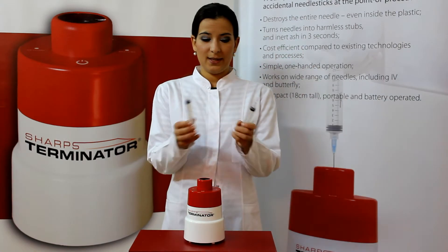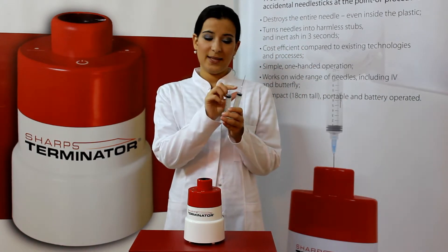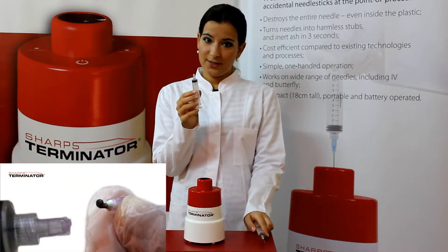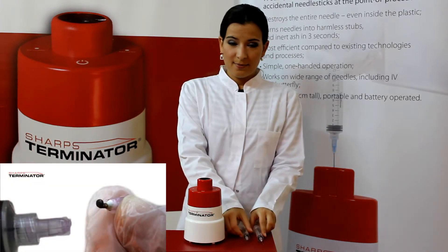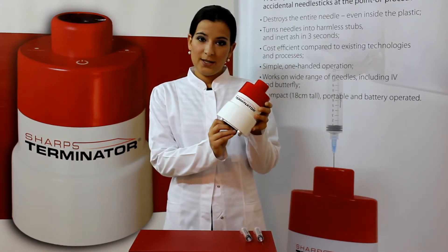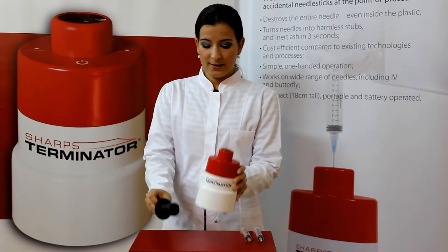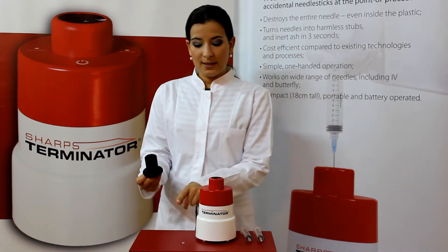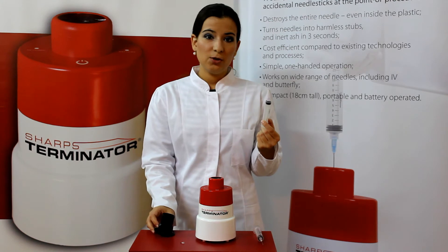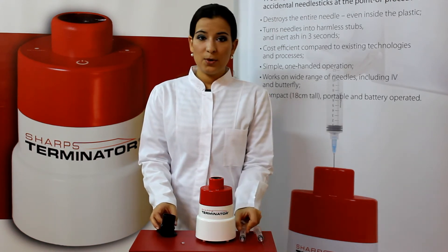The device burns the metal part of the needle and cuts the plastic hub above the needle so that no metal is left on the syringe. The metal remains of the needle then fall into a collector where they are exposed to the sterilizing light of the UV bulb. The metal remains of the destroyed needle and the plastic syringe are no longer sharp and can be disposed of according to your local regulations.